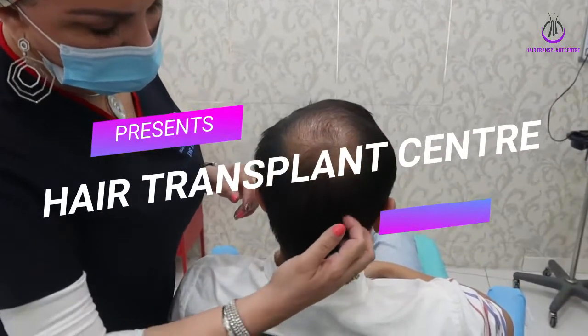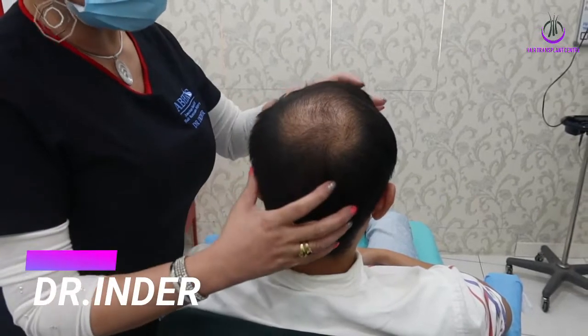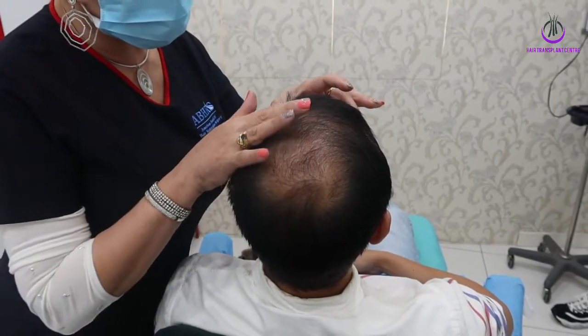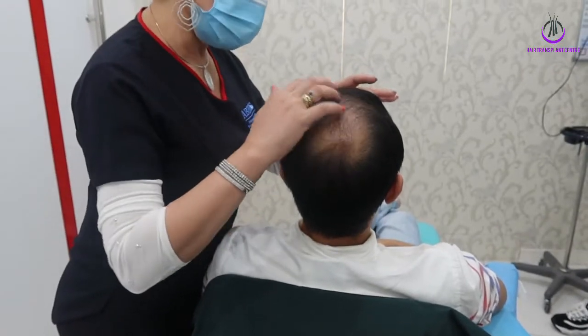Today the doctor's plan is to take hair from the donor area, give you density at the crown area, and then moving downwards from the crown area and moving upwards towards the mid-scalp.